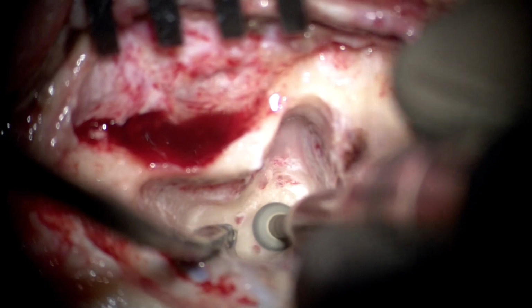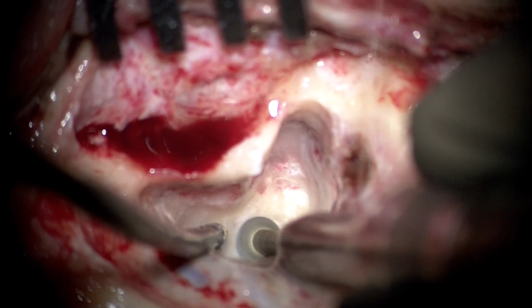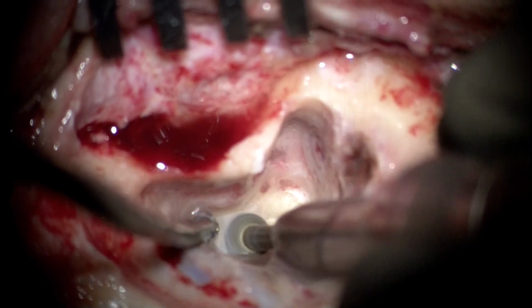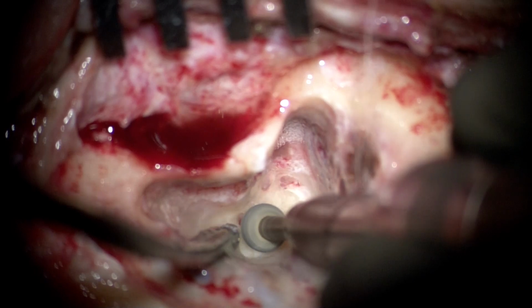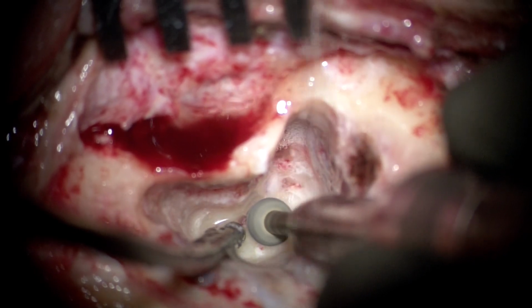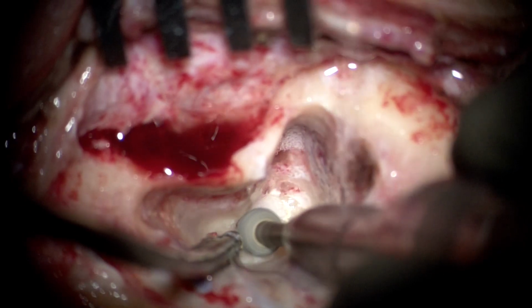Now we have shifted to a medium-sized diamond burr to completely drill out and clog all the opened ends of the semicircular canals: the three ampullas, the non-ampullated end of the lateral canal, and the crus commune, which is formed by the non-ampullated ends of the posterior and superior semicircular canal.